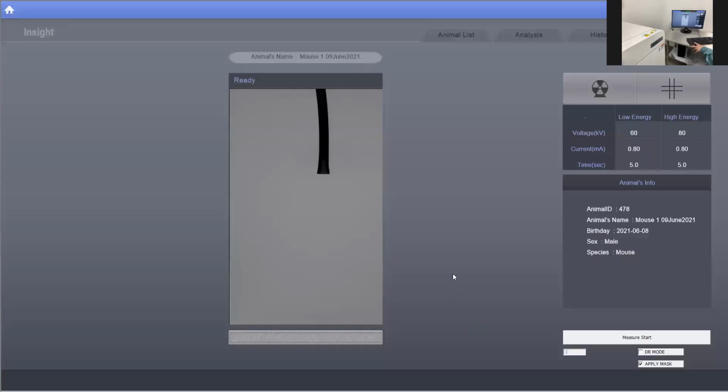Okay, and once the camera goes off, I'll have Sebastian anesthetize the animal in the knockdown chamber behind us. So I will talk you through everything that he's doing just so you can understand how fast these images can be taken. I'm taking the stuffed mouse out of the system, just so that we have that ready to go. So the animal is just going into the knockdown chamber. And normally, as with everything, it will take a few seconds for the animal to be anesthetized, again, using isoflurane.